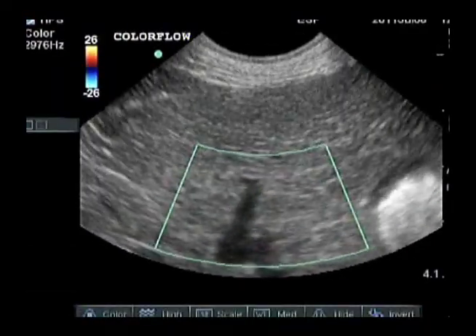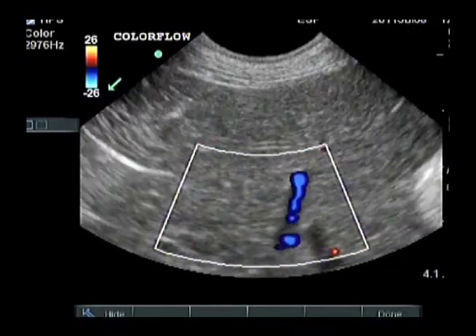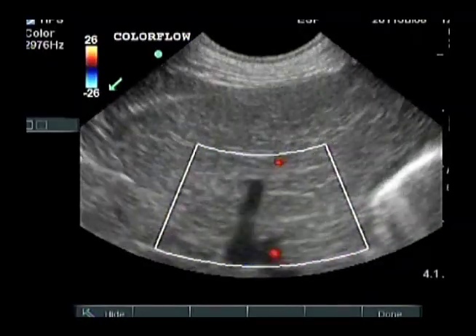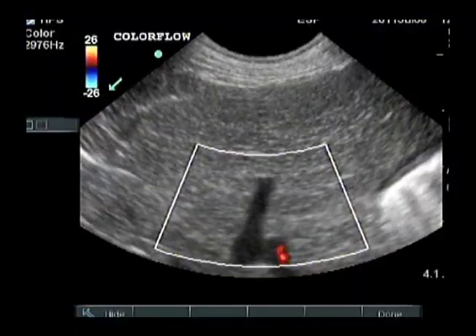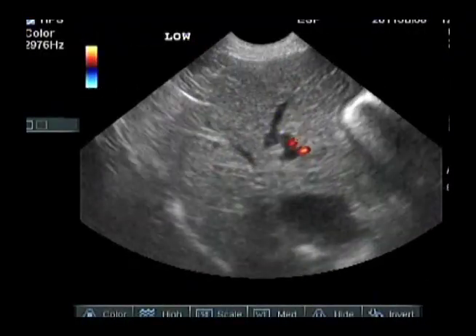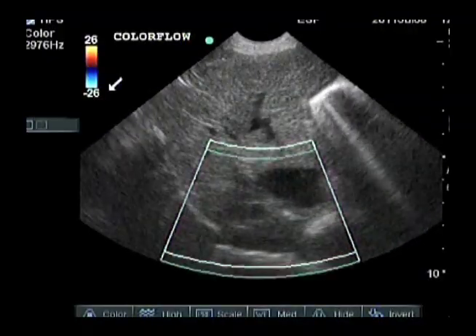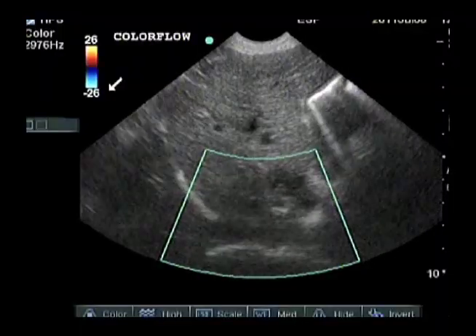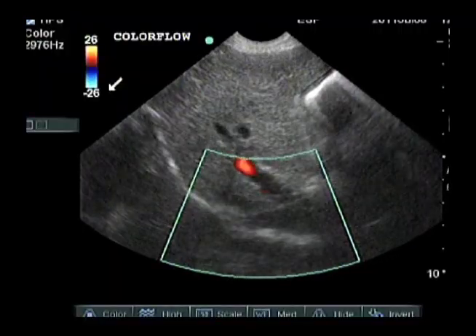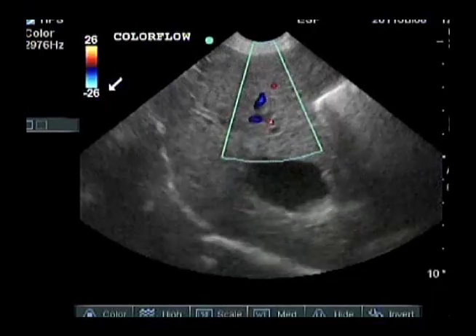Colorflow Doppler is a function of transducer frequency, depth, and computer capacity. The higher the frequency, the more limited the color flow capability. As you increase depth, Doppler capability decreases. In the abdomen, we prefer higher frequency transducers that give a more detailed two-dimensional image. Colorflow Doppler tends to work best in the near field or at shallow depths.